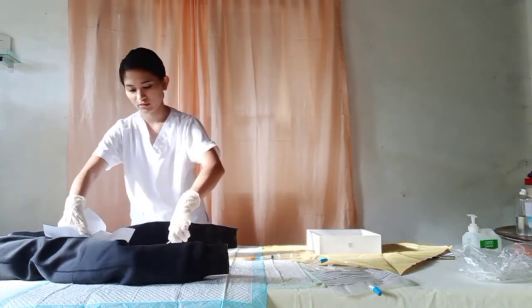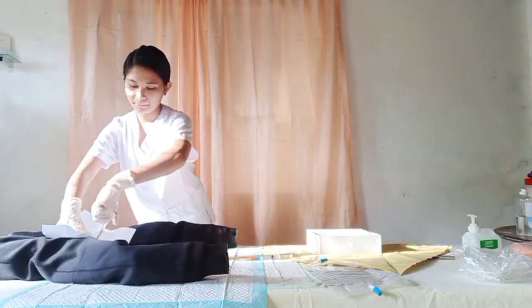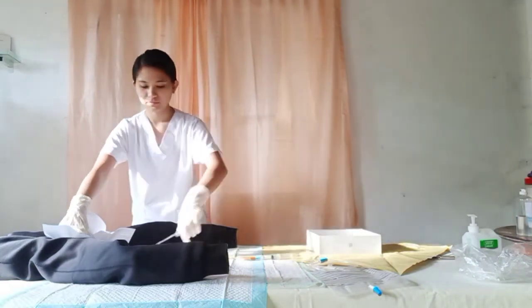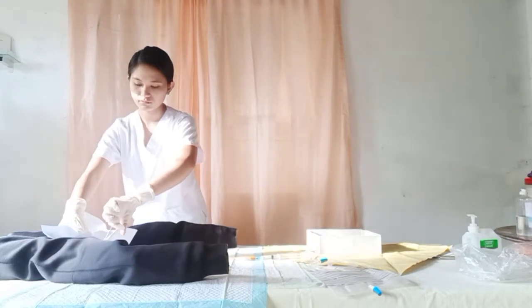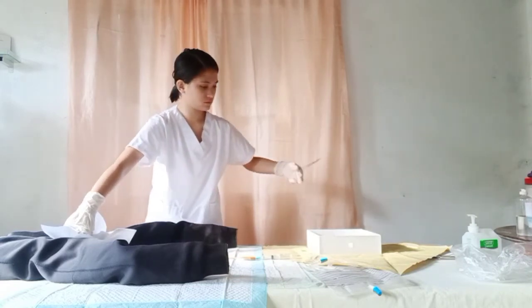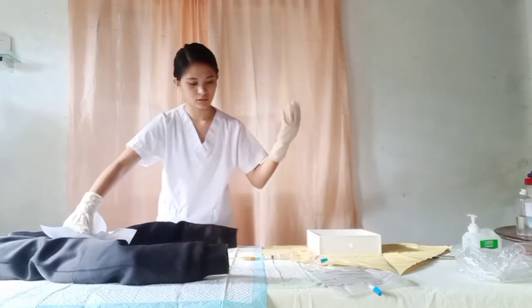Discard the other side. Okay, then the middle.